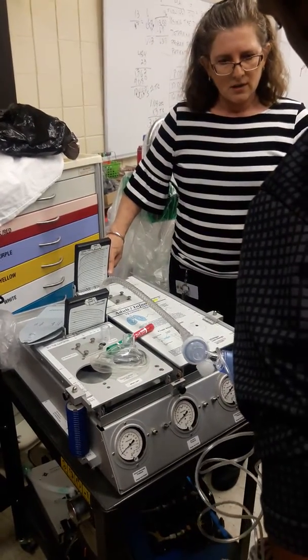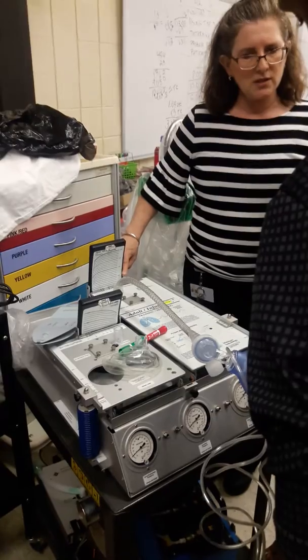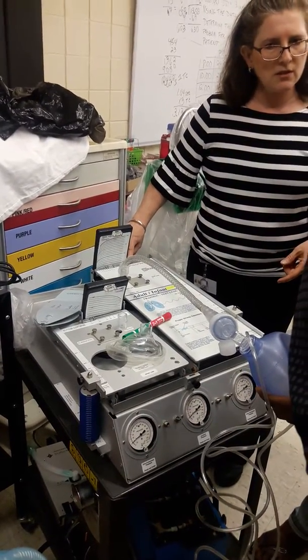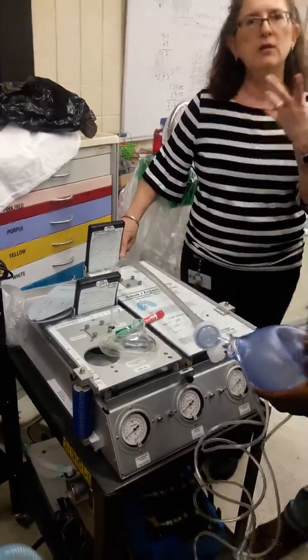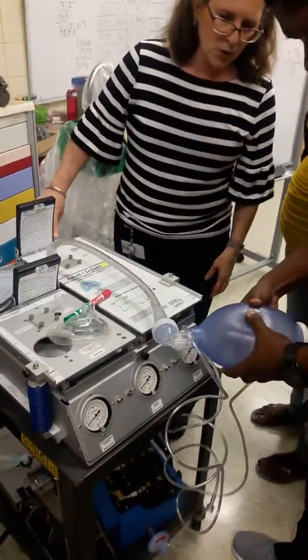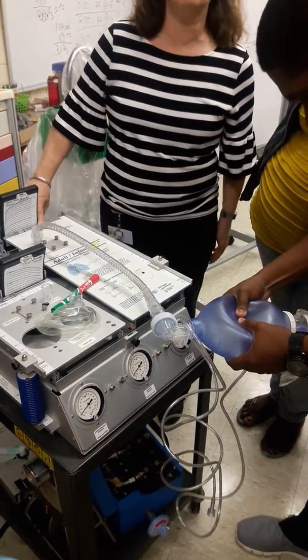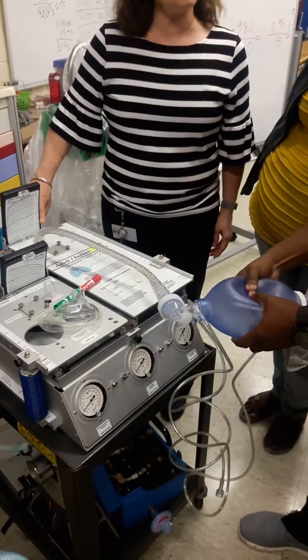And you feel how easy that is? Push it again. See how easy that is? Anybody else want to give it a squeeze? Go up to about the 500, and then hold the breath. Whatever pressure is there, that's your plateau. So it's easy to breathe.